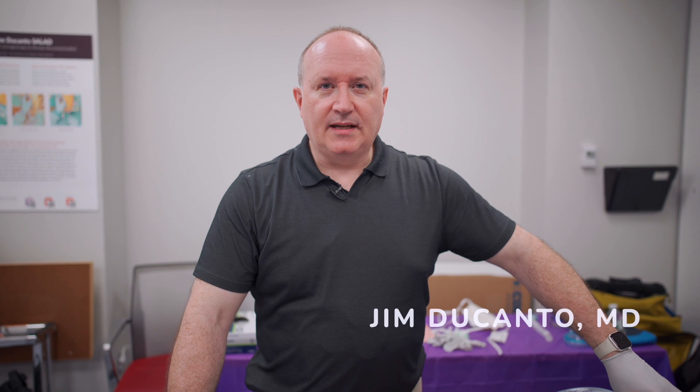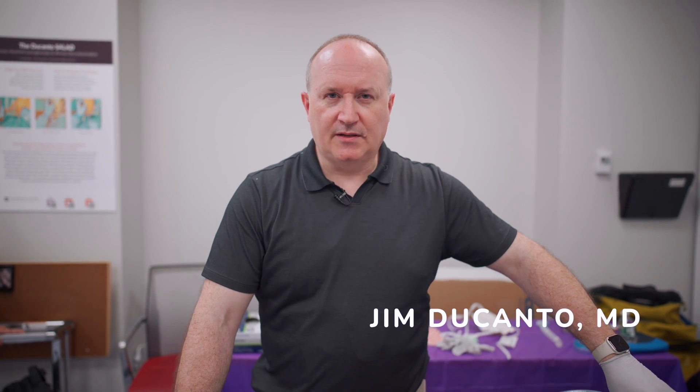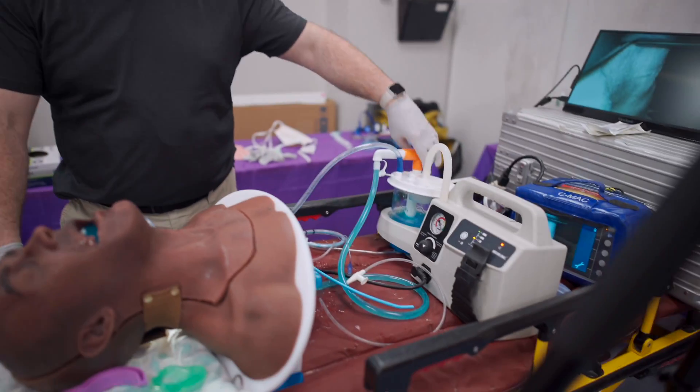This is Dr. Jim Ducanto. I'm going to be demonstrating some elements of the SALAD technique for basic airway management as well as advanced airway management. We're going to start simply with a technique by which we're going to place an oral airway while decontaminating a contaminated airway.